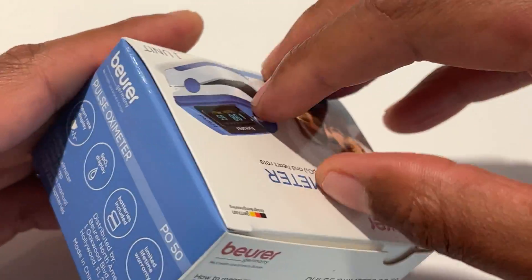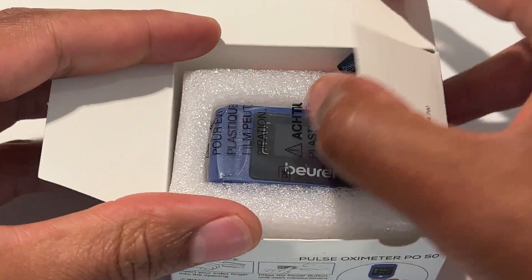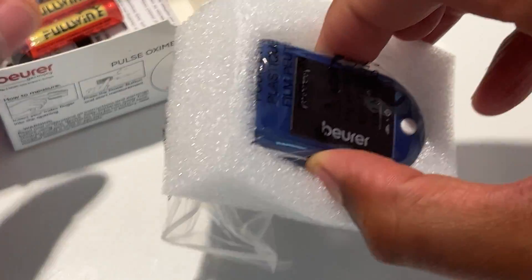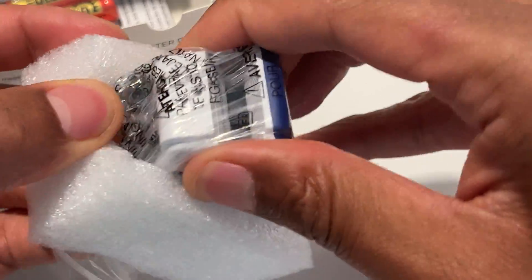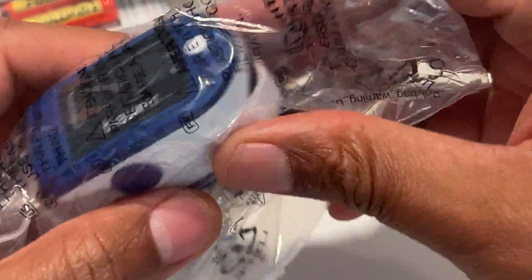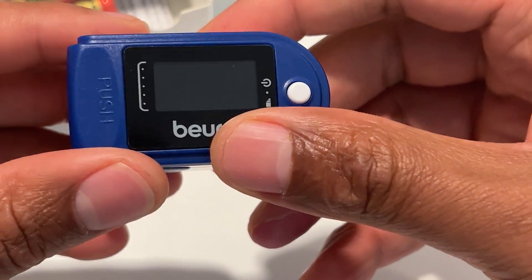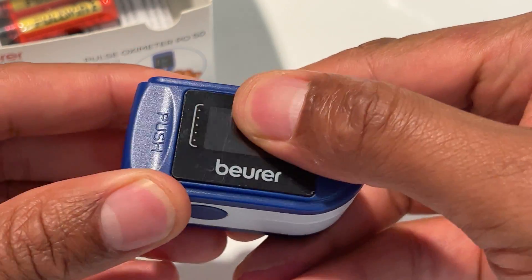Let's go ahead and open this up. On the side of it there are some instructions — I'll go over that as well. Inside we have the pulse oximeter. It comes in a nice packaging here, a plastic bag.